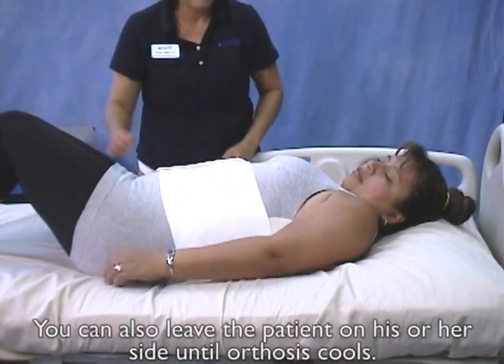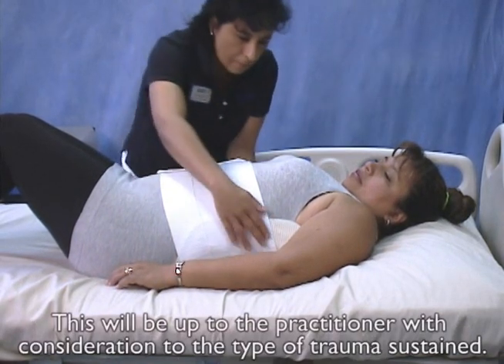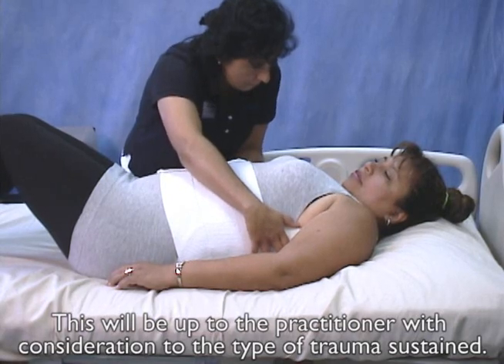Rolling the patient supine while allowing the posterior panel to cool may decrease lordosis in the orthosis. You can also leave the patient on his or her side until the orthosis cools. This will be up to the practitioner with consideration to the type of trauma sustained.